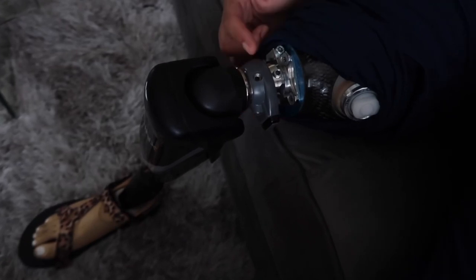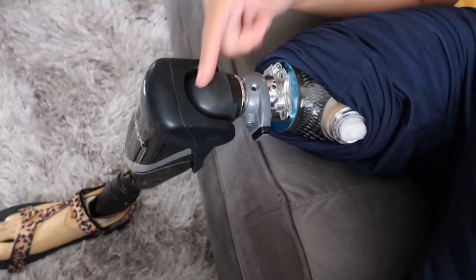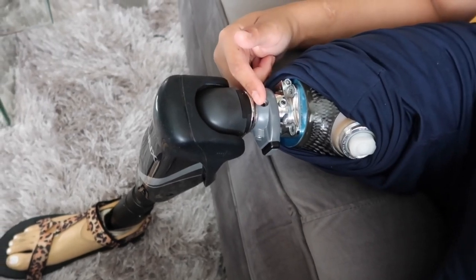Everybody is different and it's more difficult, of course, and I understand that. But the only reason I was able to get the rotator was because I had a big space between my knee and my socket. That's why I was able to get it, which was pretty cool. It is also very helpful when it comes to driving, because driving was very difficult. I would have to push my leg to the side and it wasn't as comfortable.